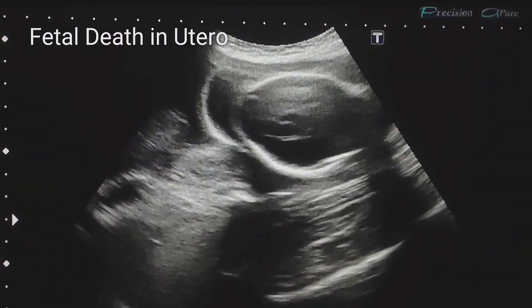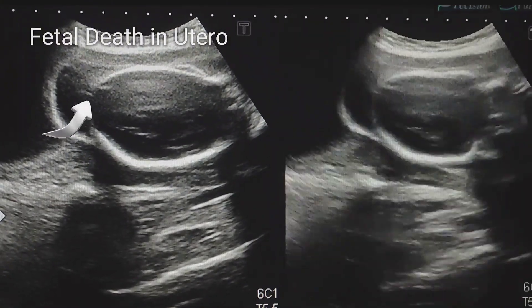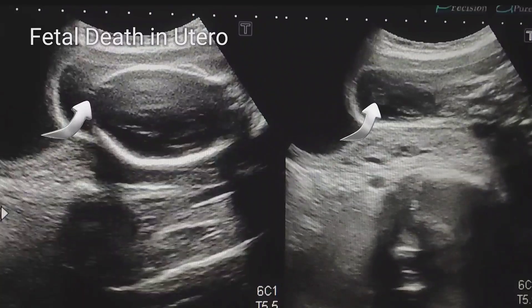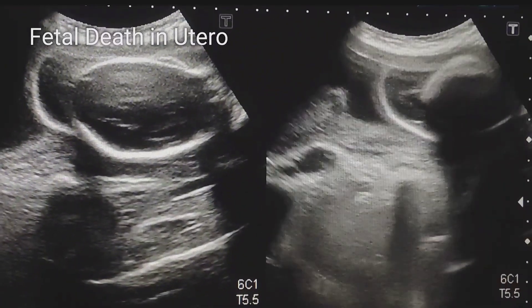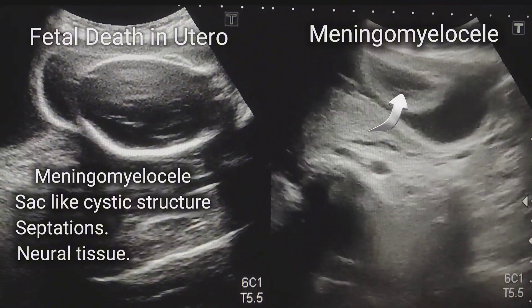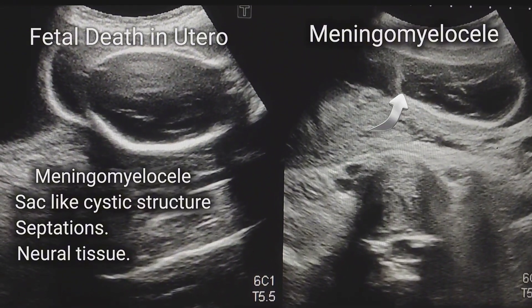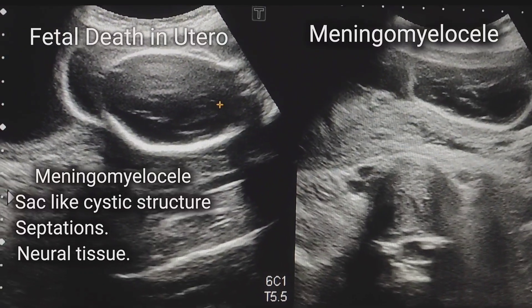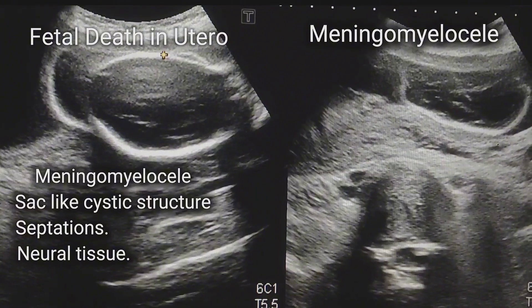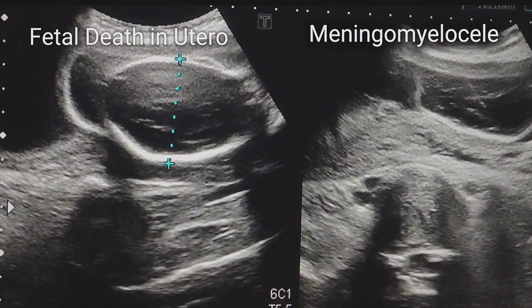As we can see in this real-time ultrasound, there is a cystic area seen around the head of the fetus. This appears to be arising from the cervical region, containing septations, and brain content also appears to be included in the cystic area. Thus, we can say this is meningomyelocele, arising from the occipital region of the fetus.